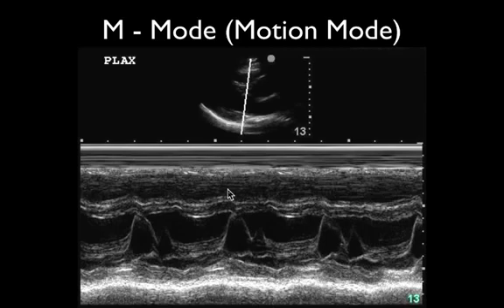We see a little bit of haziness in black here. It's hypoechoic, anechoic, and that's going to be this right ventricular outflow tract. Then this thick wall is going to be our septal wall. Then we notice we have an anechoic region, but something's moving within that, and that's going to be our mitral valve leaflet. And so we can see how close that comes to the septal wall. Then we're going to get our posterior structures down in here.